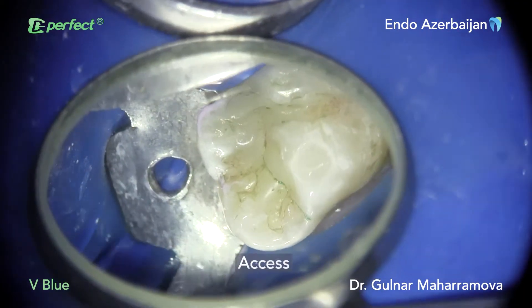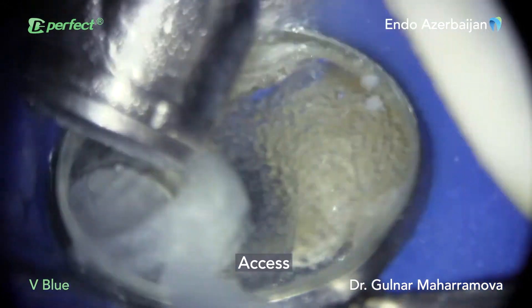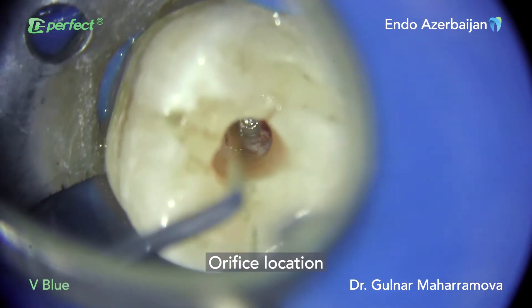After local anesthesia, I continued with isolation and access formation. The orifices of three root canals were located by means of an endodontic probe.